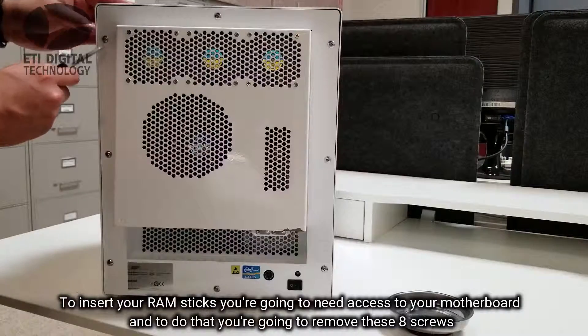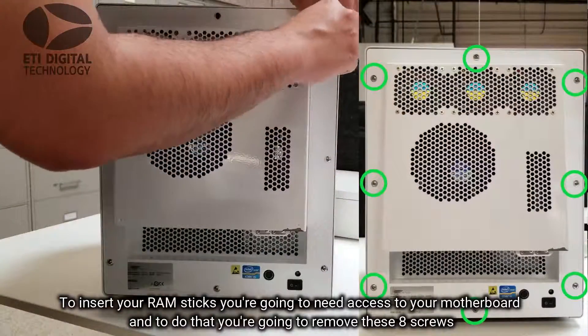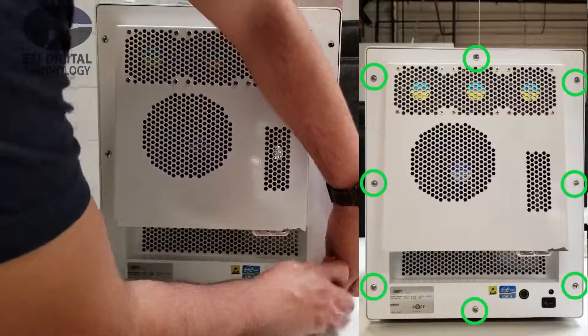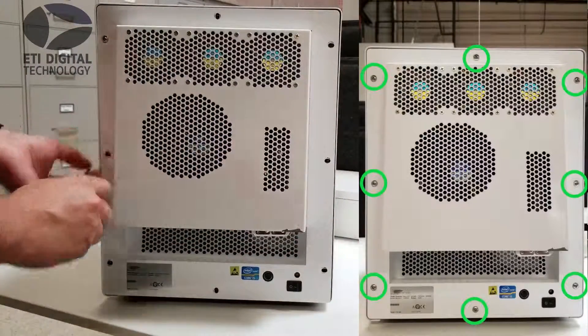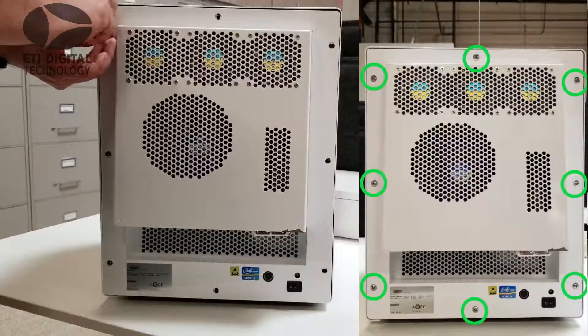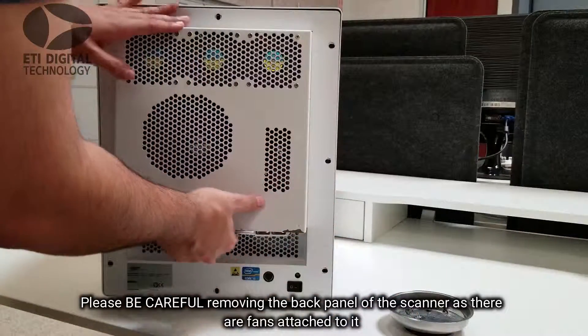To insert your RAM sticks you're going to need access to your motherboard, and to do that you're going to need to remove these eight screws. Please be careful removing the back panel of the scanner as there are fans attached to it.